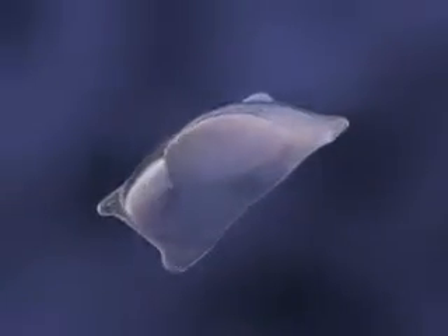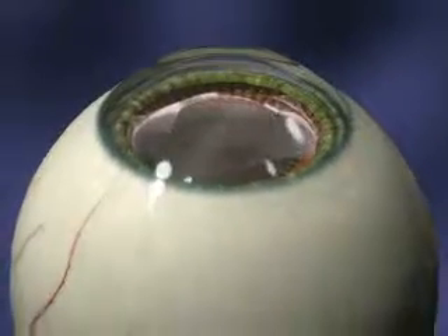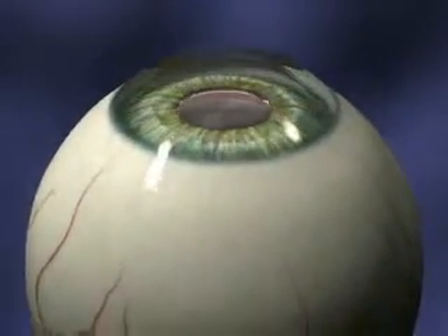Your doctor has determined that you are a good candidate for the Star Vizion Implantable Collamer Lens, or ICL. This short video will demonstrate the steps your doctor will take to insert the lens during a short outpatient procedure.